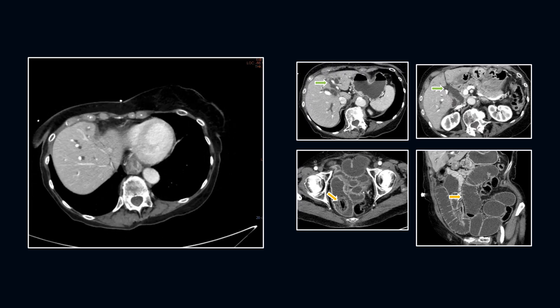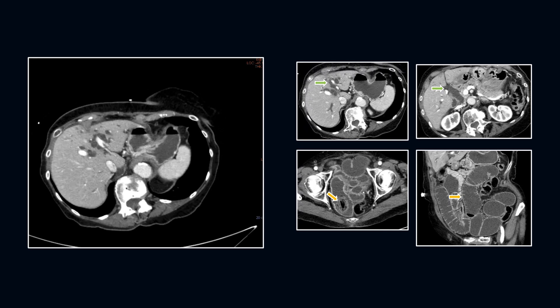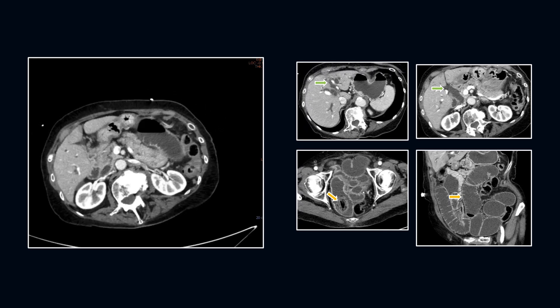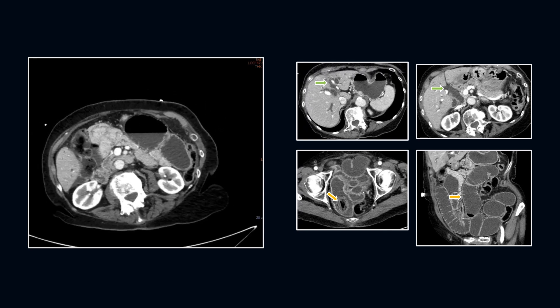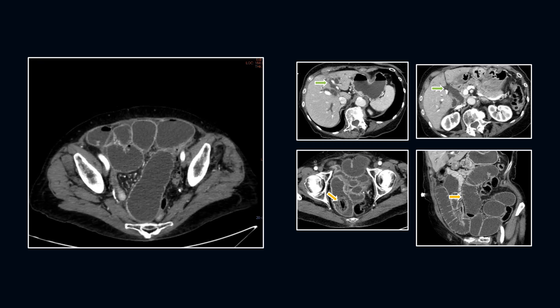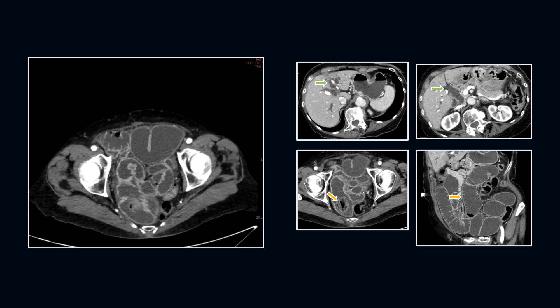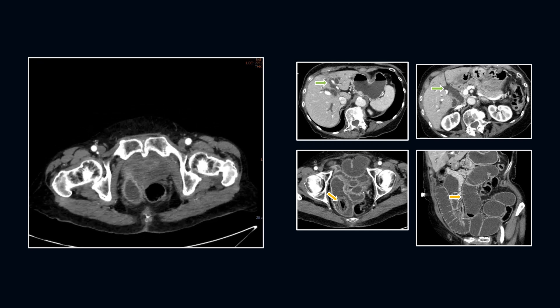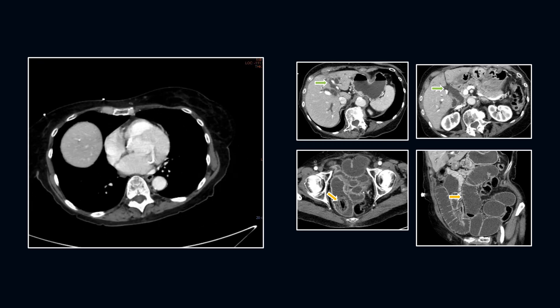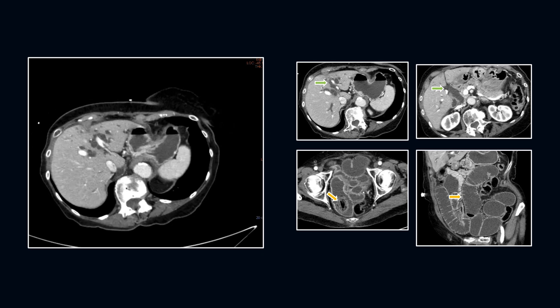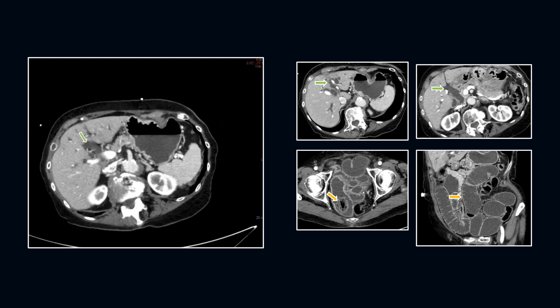On CT, the diagnostic signs include signs of small bowel obstruction, ectopic gallstone, and abnormal gallbladder either completely filled with air, showing an air-fluid level, or having fluid accumulation with an irregular wall.